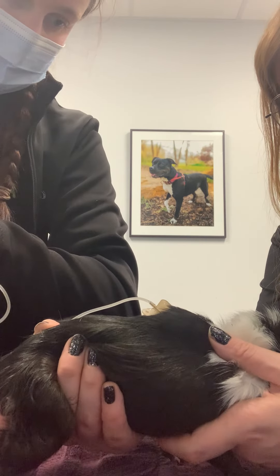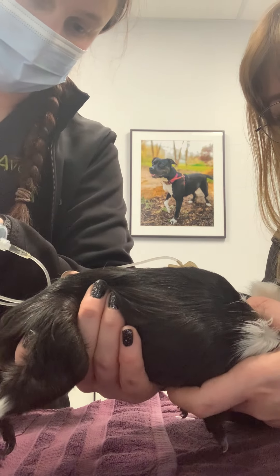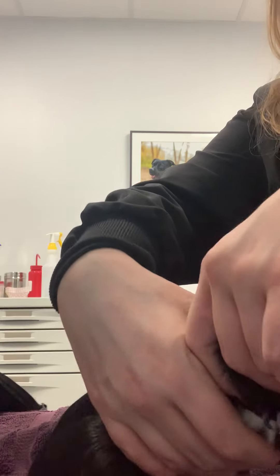And then we'll just pull the needle out, hold our hole for a minute, and then we're done. He's trying to kill it.